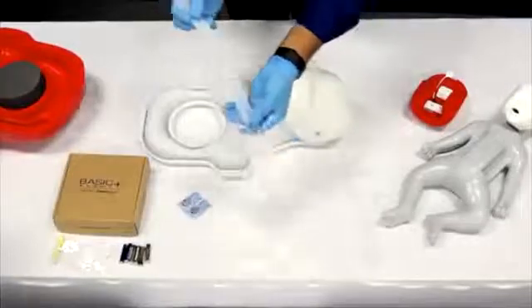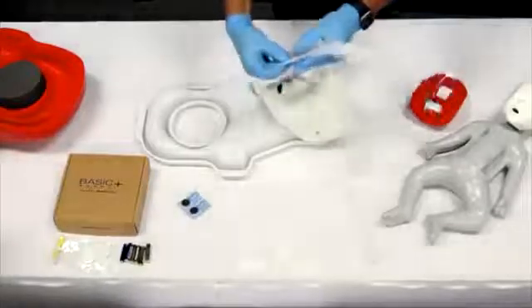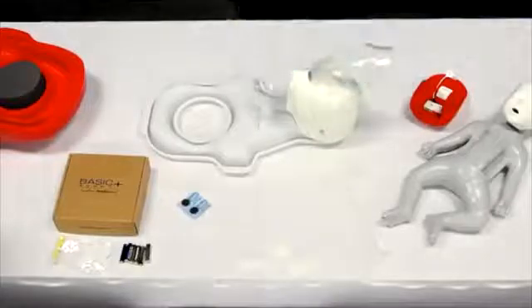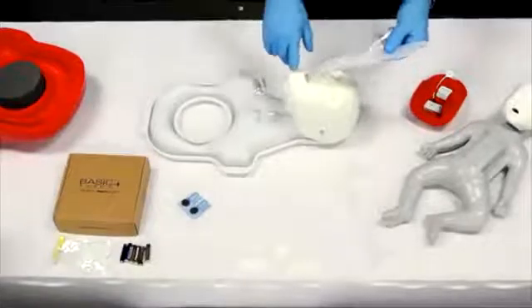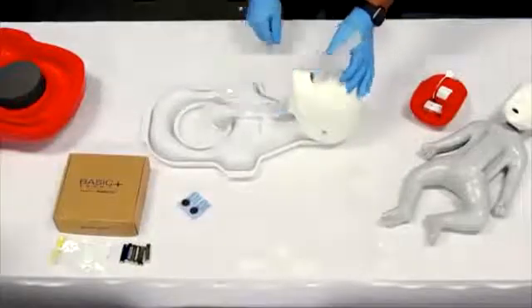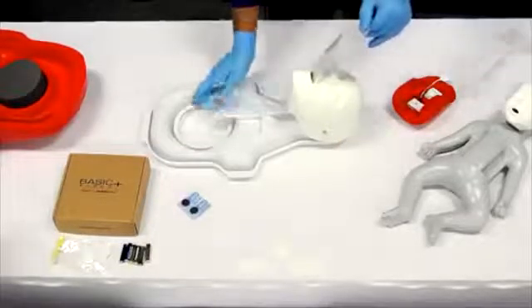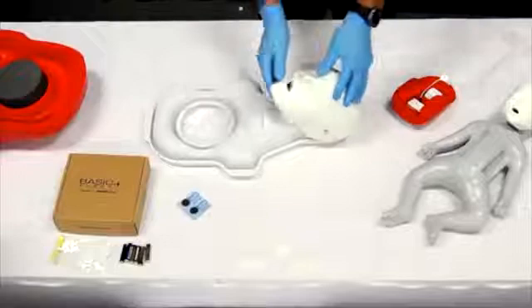The lung side of the lung bag goes into the mouth of the mannequin. Push the insertion tool and face shield lung bag down through the chin of the mannequin. The lung portion of the bag will rest on the white base, and then on the infant, it will just rest right on top of the body. So once you have it in there, you can go ahead and pull the insertion tool free from the installed bag. And then you just form your face shield over the mouth.